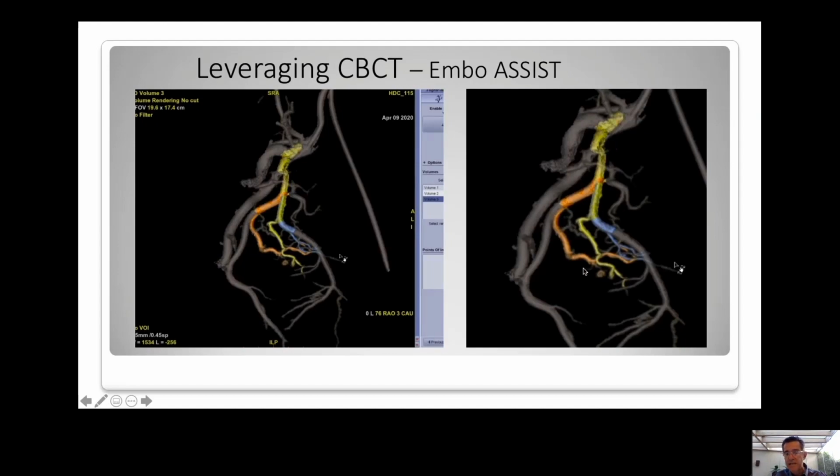And here you can see that we got this reconstruction of the path of the arteries, and also we correlate all these branches to the axial view and sagittal view, mainly for a better understanding of the prostatic arteries, and also using this software to catheterize the arteries and avoid radiation, because we don't use DSA anymore to get these images.